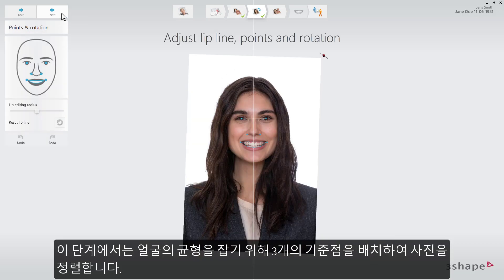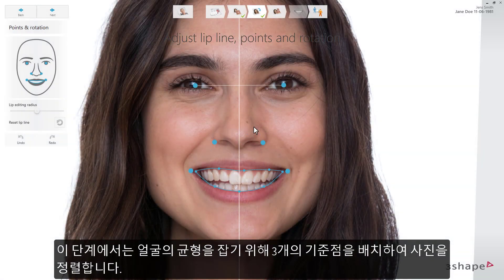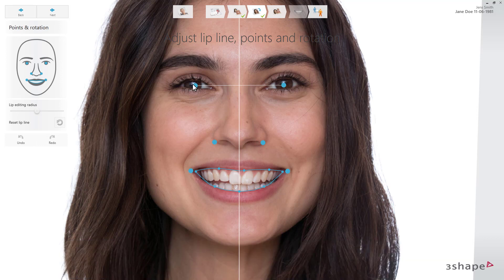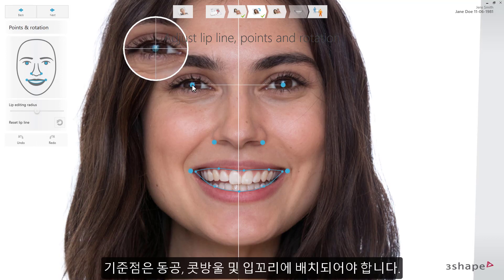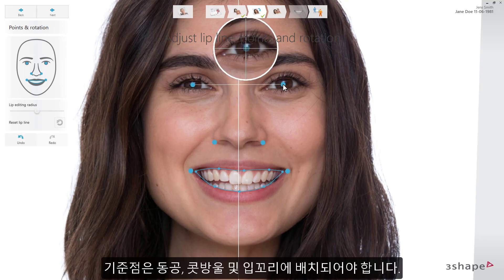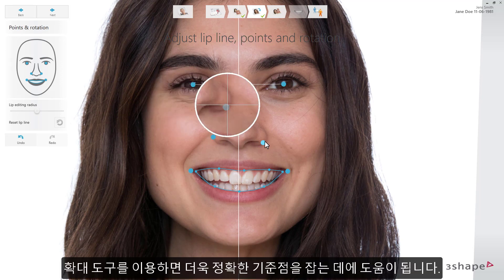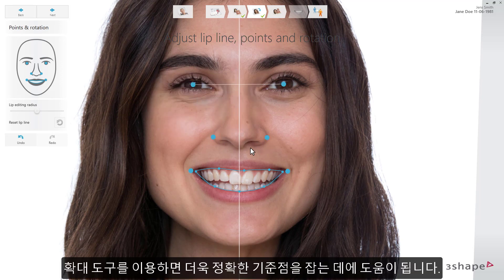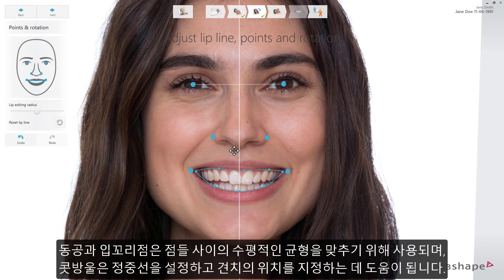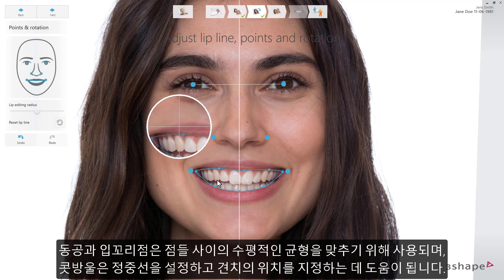In this step, you will align the photo by adjusting the placement of three sets of reference points. Make sure the points are placed on the pupils, nasal wings, and commissures. You can do that in any order, while using the magnifying tool to help with precise placement. The pupil and commissure points are used to find the horizontal balance between the points, while the nasal wings help set the midline properly to dictate the canine position.